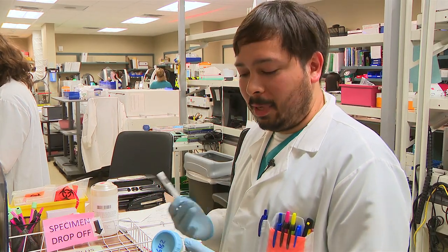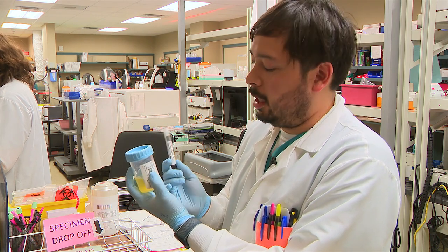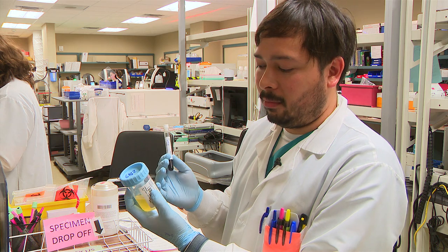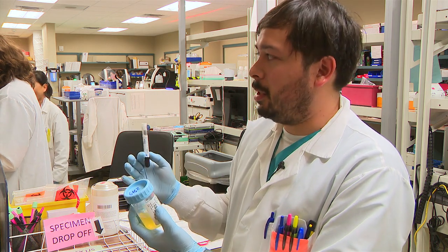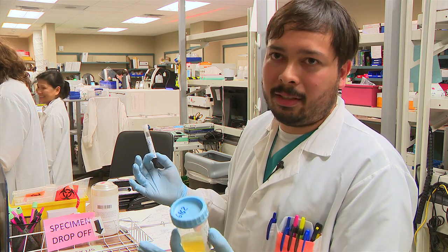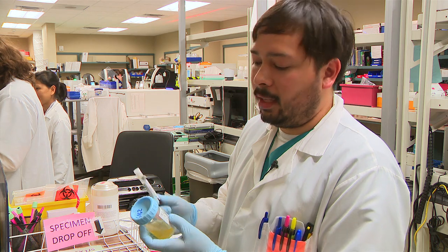Hi, welcome to Bellevue Lab. My name is Danny. Today we're going to show you how to run and process a urine and a chemistry test in our lab. We're going to take it from it coming down the tube station all the way to racking, and you'll see all the processes in between — how we decant things, et cetera.